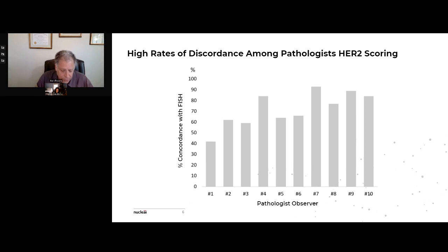The first approved companion diagnostic test was the HercepTest from Dako, which is now Agilent. HercepTest was an immunohistochemical assay that measured the amount of HER2 protein expressed on the surface of invasive breast cancer cells. Patients showing 3+ overexpression of HER2 were deemed eligible for trastuzumab therapy.